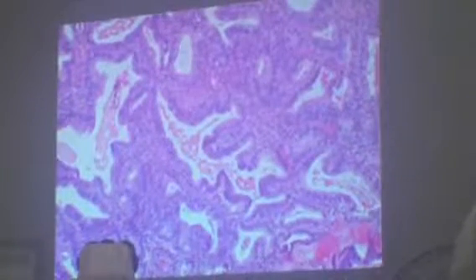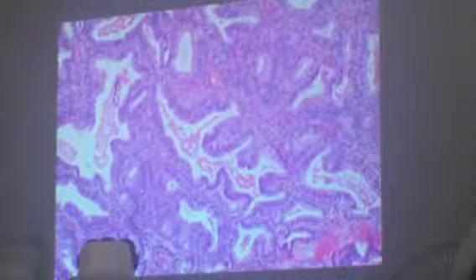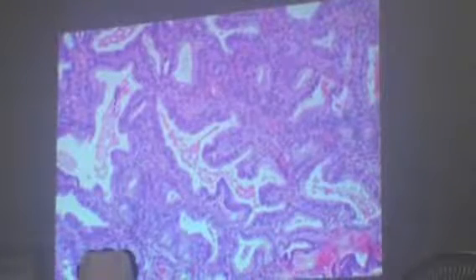So that is why we call it complex hyperplasia. Again, in some cases, you have to look carefully and rule out a polyp. But more often than not, complex hyperplasia is really complex hyperplasia. Okay, simple hyperplasia may not always be simple hyperplasia if you see the fibrovascular core, because it can be disguised as a polyp. Okay? Or rather, a polyp may be disguised as simple hyperplasia. But normally, polyps do not have the irregularity of a complex hyperplasia. Okay?